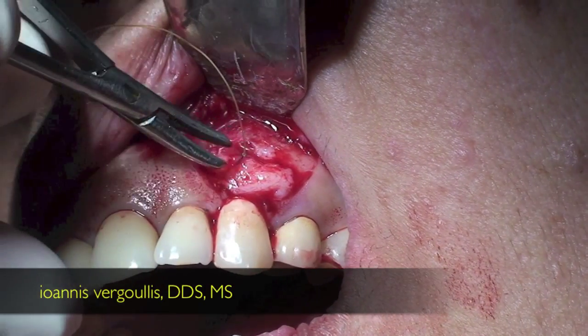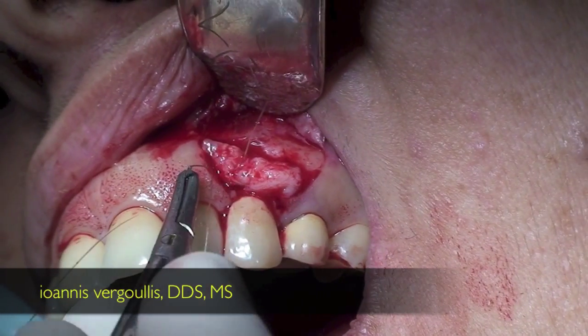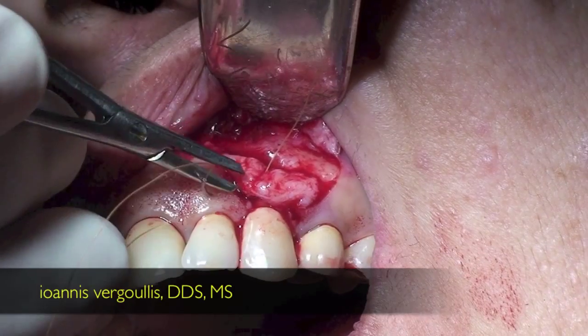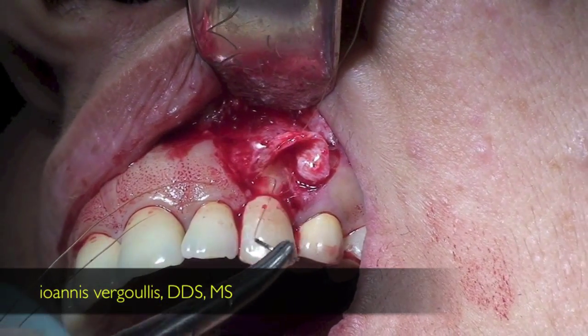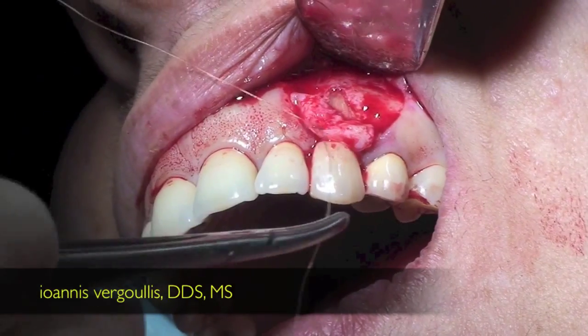Now we will stabilize the graft and we utilize 5-0 chromic gut suture coming from the connective tissue graft outside of the flap and again from outside of the flap towards inside in order not to have overlapping of the connective tissue graft with our incision line.